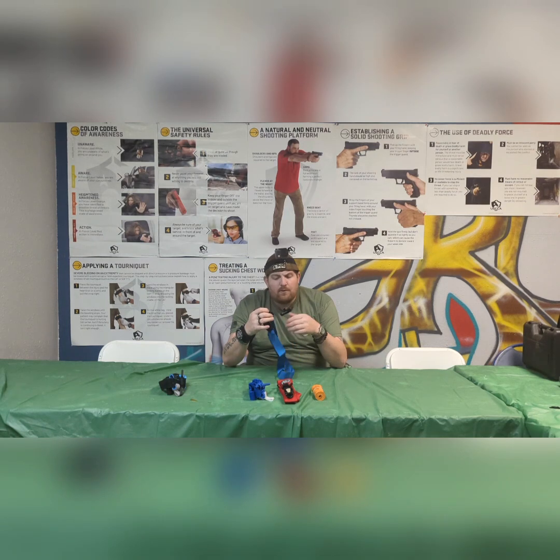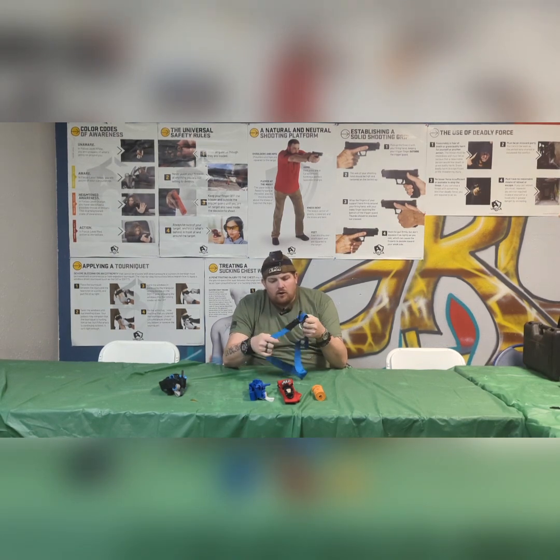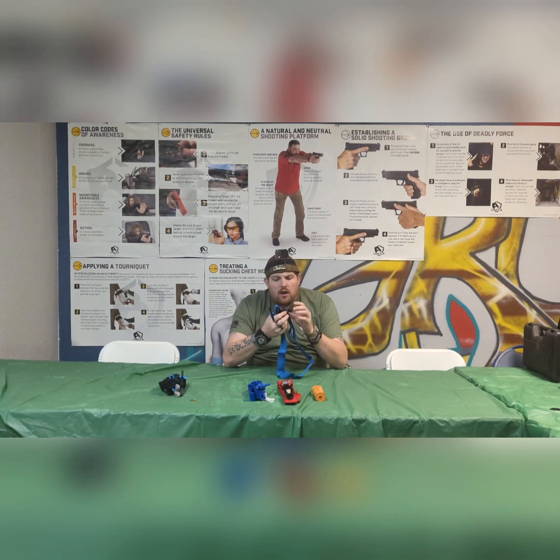It's called a Special Operations Forces Tactical Tourniquet. Some people just say SOFT. It's a soft tourniquet, or a Special Operations Force tourniquet. Great, heavy duty. The thing I love the most about this is that it has metal on it. It's got a metal windlass. It uses friction versus Velcro. Like the CAT tourniquet uses Velcro, this uses a friction lock.